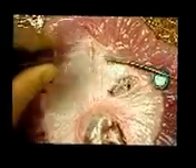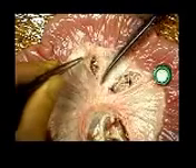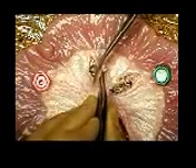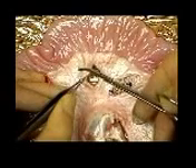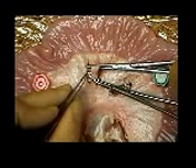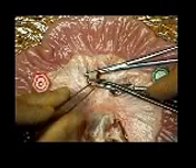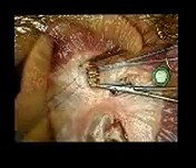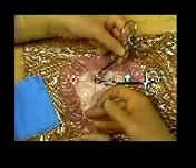When ligating a pedicle, it is first necessary to dissect it free of surrounding tissue. Two hemostats are placed on the pedicle with the curve of the jaws facing each other. The pedicle is then divided, leaving an adequate cuff of tissue on either side. The assistant then takes one hemostat and the surgeon passes a length of ligature around the pedicle beneath the hemostat.